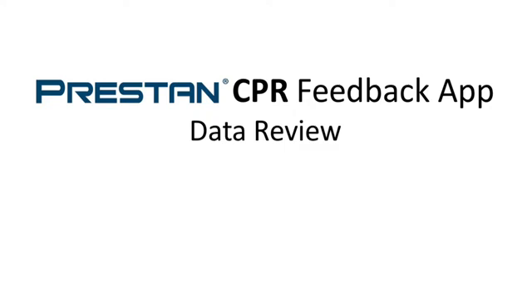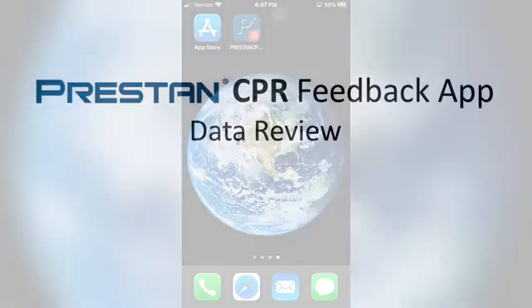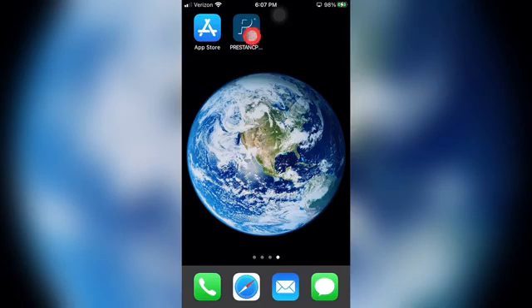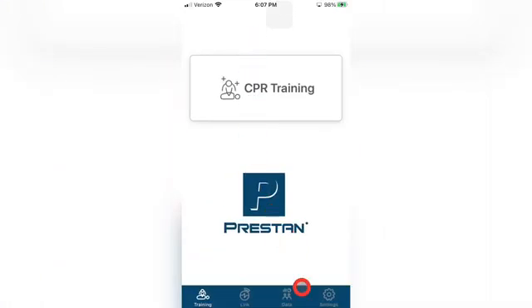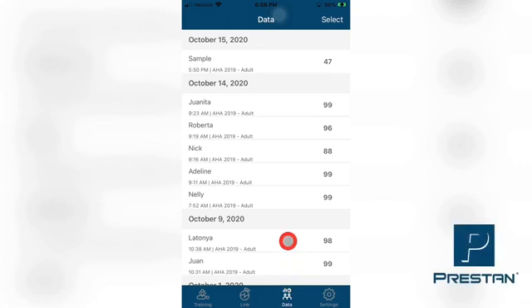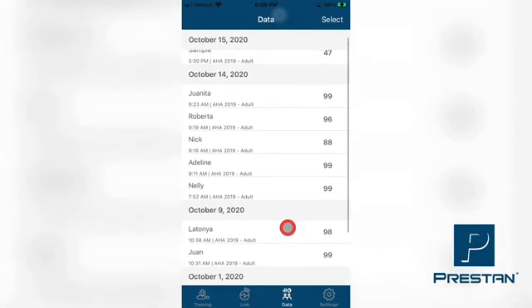Data Review: the detailed data for each student in your training session is recorded and stored in the PRESTAN CPR Feedback App. This data can be retrieved immediately at the end of each training session, or it can be retrieved at a later time for review and documentation of the results. To retrieve the detailed data, select the Data tab at the bottom of the screen. This will bring up a list of all the historical data collected from your training sessions. The overall list shows the name of the mannequins, or the student name if temporarily renamed, along with the date and time the data was collected, the guideline used in the training, and the overall score the student achieved.